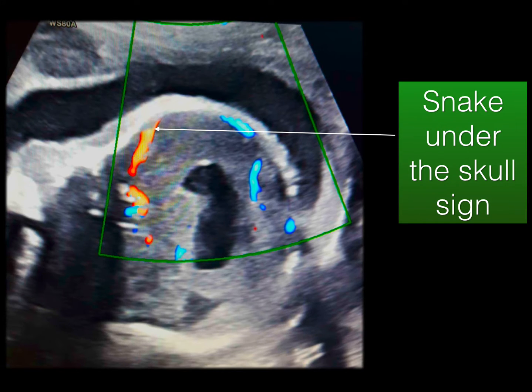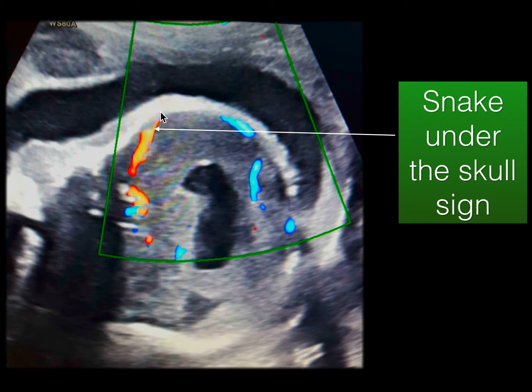One more important sign in holoprosencephaly to remember is the snake under the skull sign, which is where the anterior cerebral artery courses just beneath the skull instead of coursing around the corpus callosum. This is because of diffuse brain parenchyma — the ACA courses along the anterior aspect of the brain beneath the skull. Always apply Doppler to assess the course of the anterior cerebral artery.